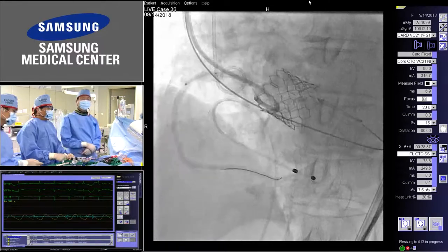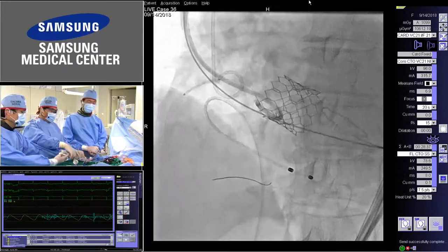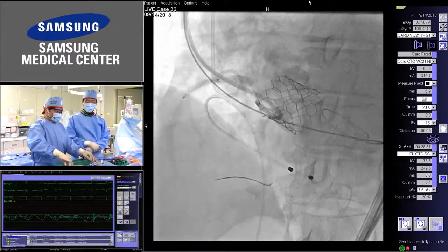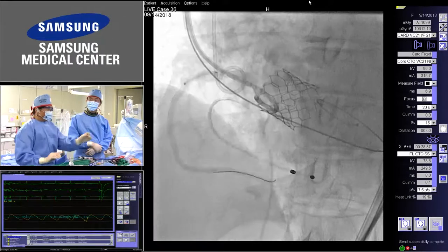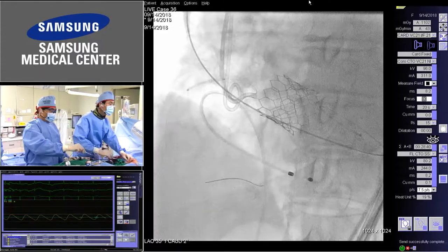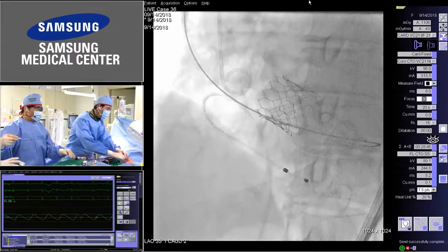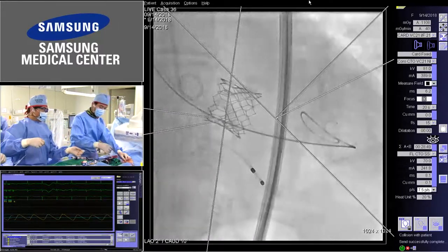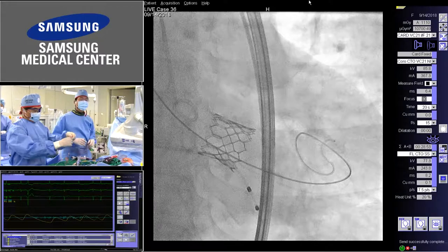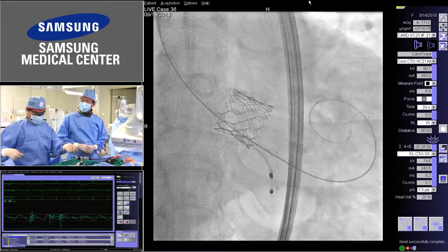It's above the valve. That's what I learned: I don't trust the balloon sizing and the right coronary angiography during the balloon inflation. Now I learned that it's not trustworthy. I removed the guiding catheter anyway. To be frank, the balloon is much longer, and the balloon can obstruct the coronary artery. That's what I learned for sure from this case. But initially I planned the wire in the right coronary because of that calcium, and I thought it was a good choice.